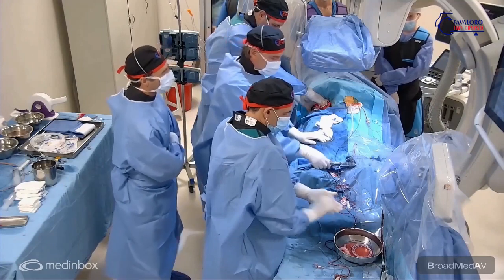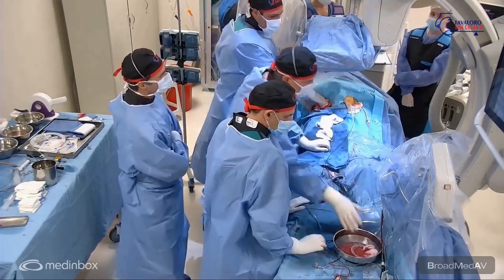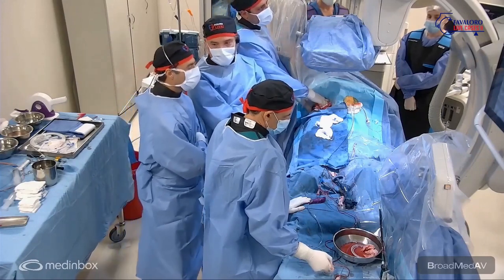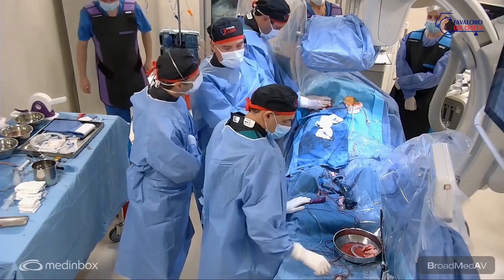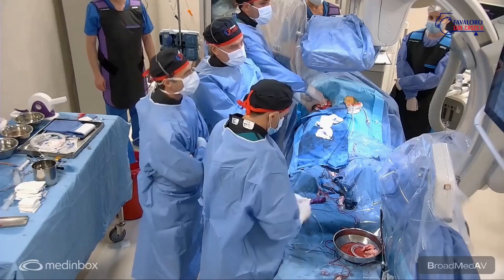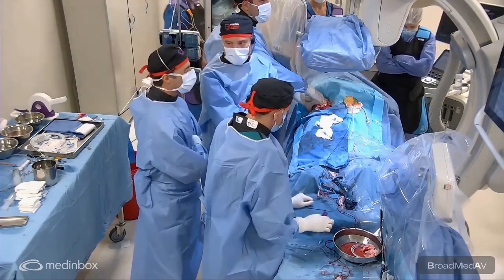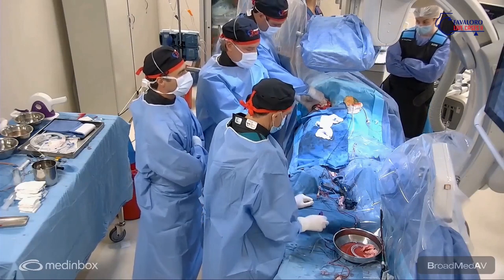Good. So, okay. At the end, what we are showing here is that the TAVI field still needs development of closure devices. Yeah, this is a good point. Valves have been developed faster than closure devices. We only have very few. We don't have MANTA here in Latin America, but to be honest, I don't know if there is a huge difference between suture-based and plug-based devices. Yeah, that's a good point too, especially in these very obese patients.